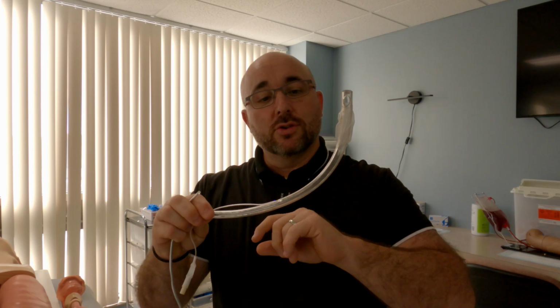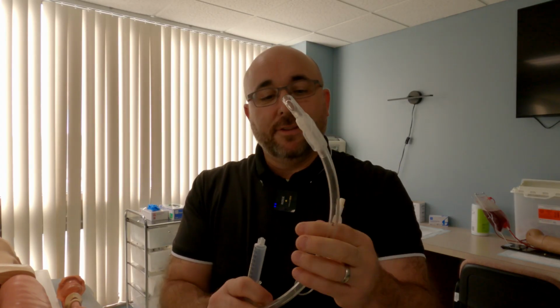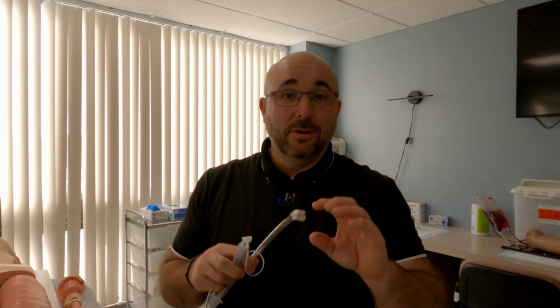This comes out, and we usually kind of leave it in the package. But one thing we definitely have to do, and it's a part of that job of assisting with intubation, is checking this cuff. So this is the cuff that actually seals inside the airway. And so this doesn't hold it in, but this has to inflate to occlude the airway so that when we deliver air in, it will go directly to the lungs and not take the path of least resistance, which is out the mouth. That would do really no good if we were sticking a tube in and it didn't seal.